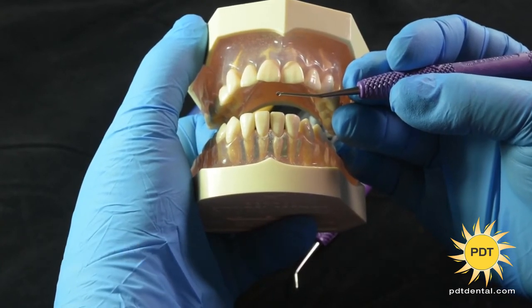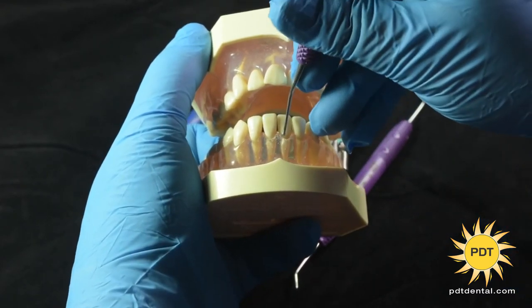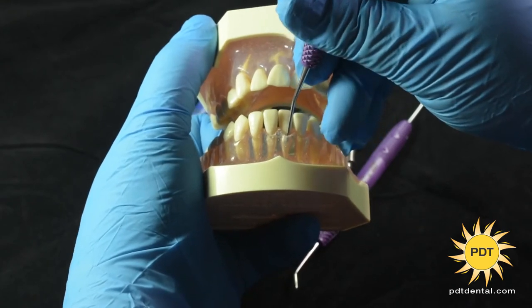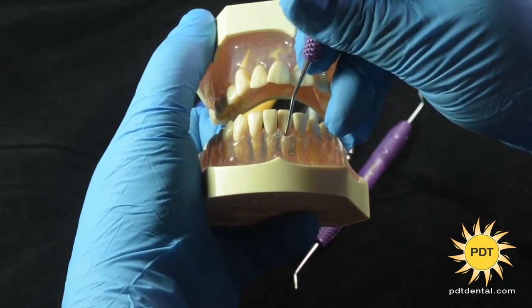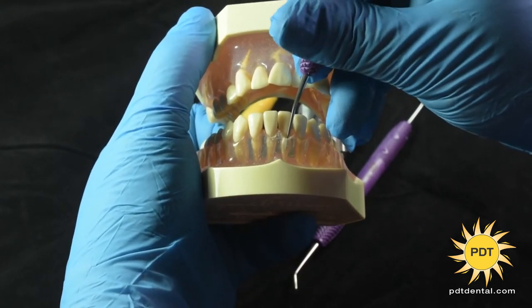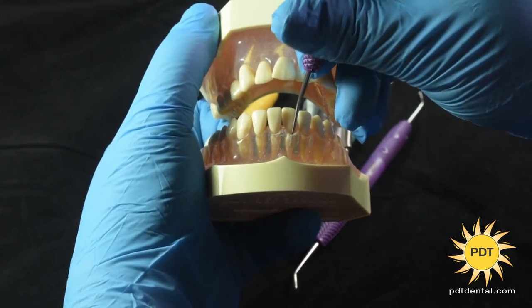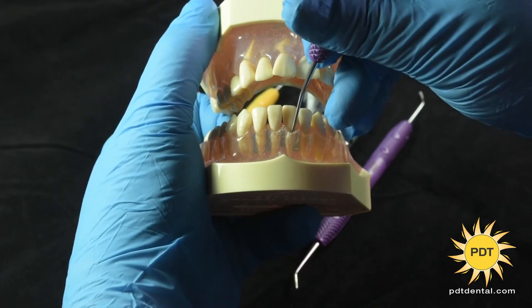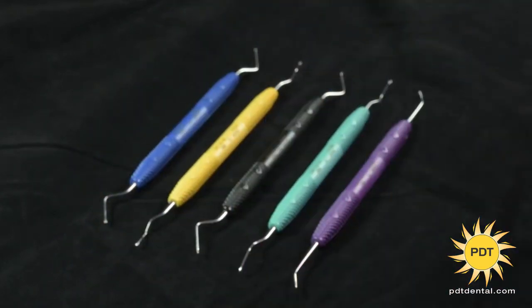The unique scoop design has a cutting edge of 270 degrees, which enables access into deep periodontal pockets with minimal tissue trauma. Once subgingival, you can move the scoop in multiple directions for effective calculus removal on irregular root surfaces and furcations, with very little discomfort for your patient.